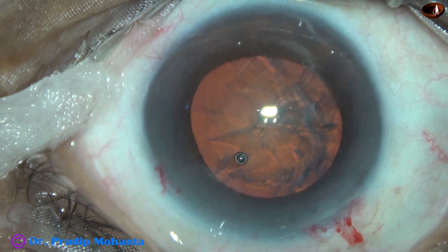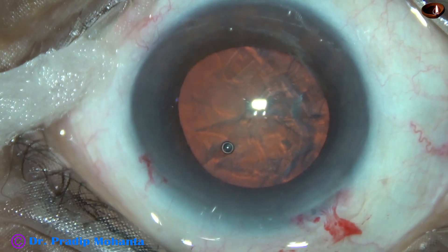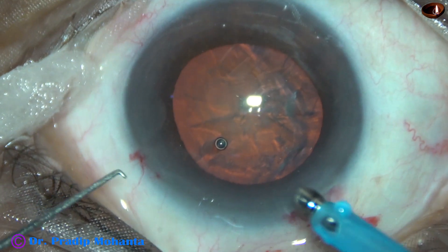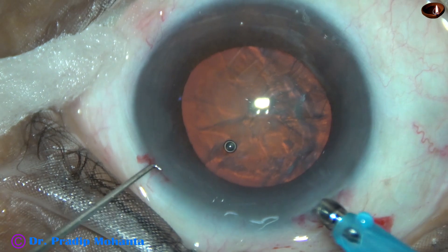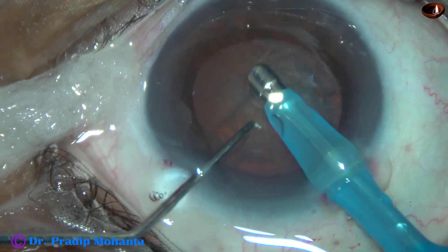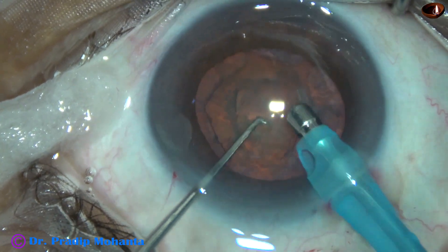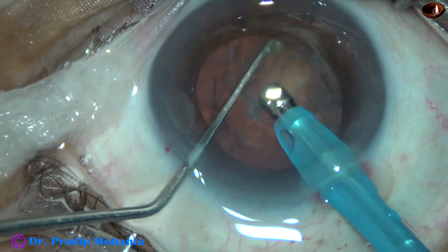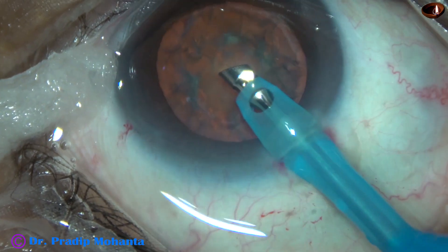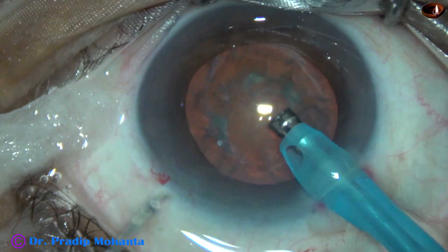Now is the time to go into the eye with the phaco needle, and the phaco needle enters into the eye with its bevel down. The bevel of the tip of the phaco needle is towards the lens mass. Some superficial cortical lens matter is removed. The nucleus is rotated clockwise and anticlockwise. Now the handpiece is turned and the bevel is made up towards the cornea.